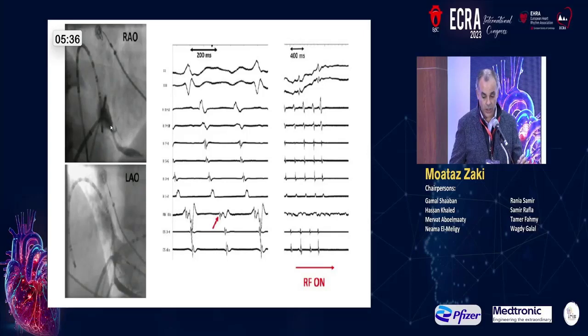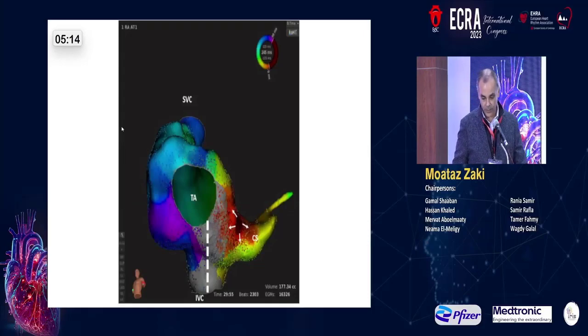So just by a focal ablation at this breakthrough site, which was identified again by high density mapping, there was immediate termination of the flutter, which couldn't have been done without this focal ablation inside the coronary sinus. And he described a right atrial coronary sinus epicardial connection. This is what you see with the focal breakthrough and epi-endo communication at the os of the coronary sinus.